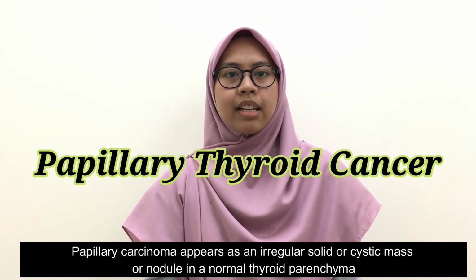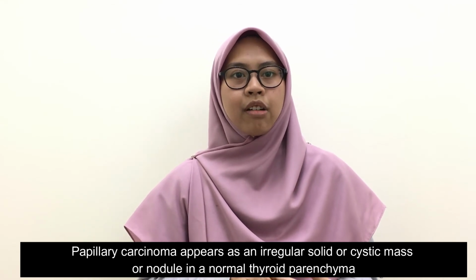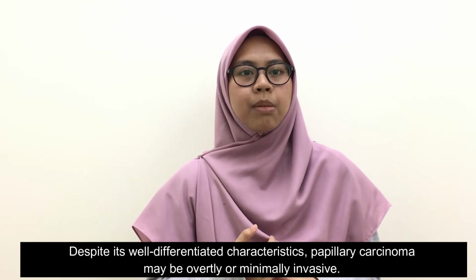Carcinoma appears as an irregular solid or cystic mass or nodule in a normal thyroid parenchyma. Despite its well-differentiated characteristics, papillary carcinoma may be overtly or minimally invasive.